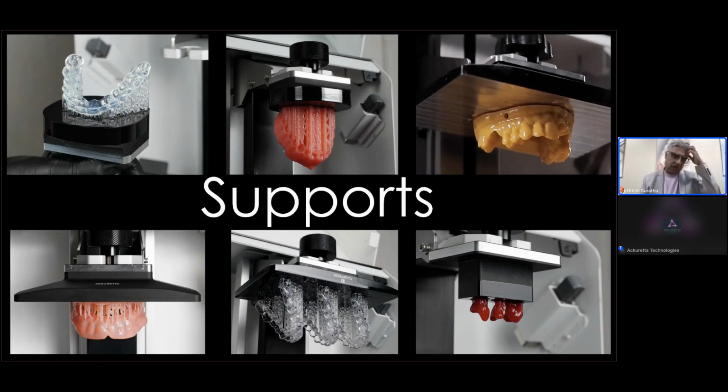I mean, upper left corner, that one's a splint. In the center there on the top, that's denture, nicely printed. Lower left again is another denture resin, printing beautifully. There's a few splints on the lower central picture. There's a few castable crowns there on the lower right. All of these are well-supported prints.